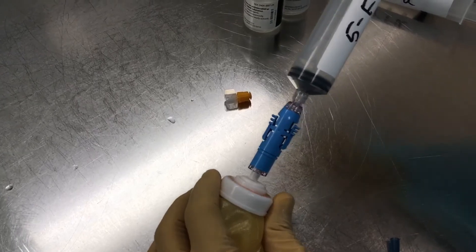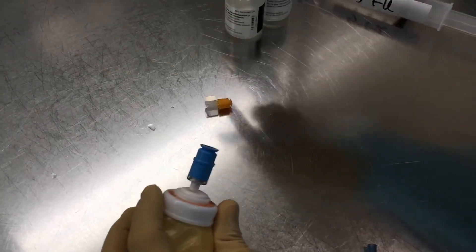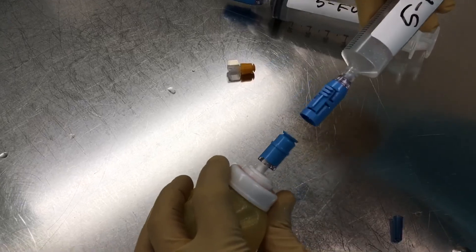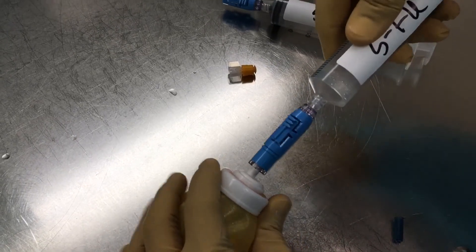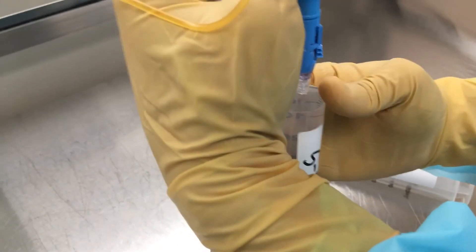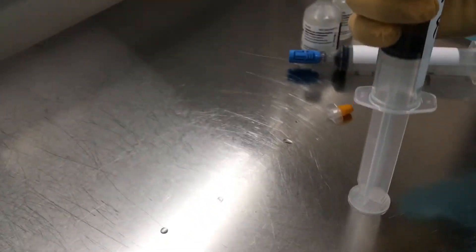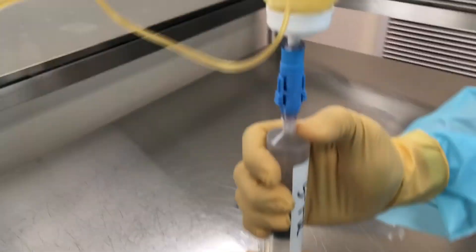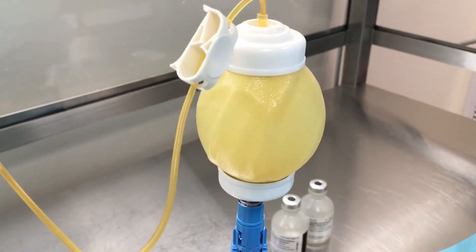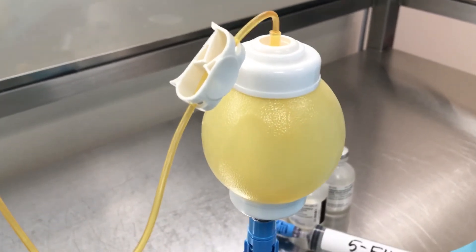This is your 5FU going into the pump. That's the rest of it. Large volumes are easier to rest on a bench and just flush it in.